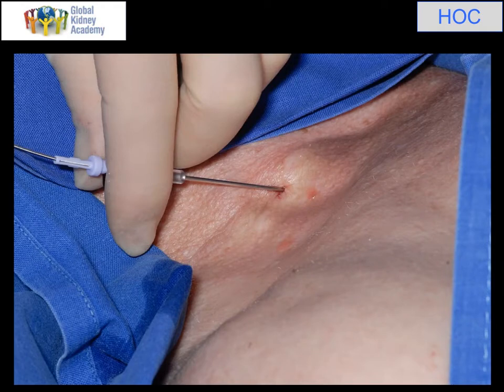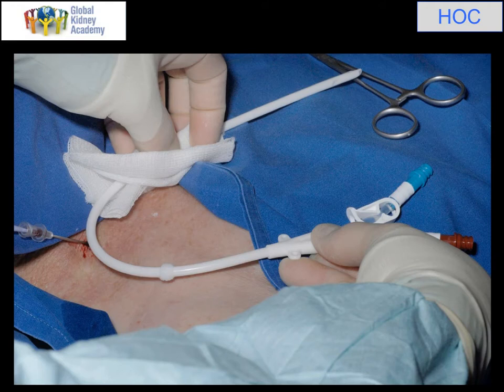I've now passed a wire through that needle. I've put some mosquito forceps clamps across the chest wall and I've used fluoroscopy to confirm that this is the middle of the right atrium. Now I'm measuring back with the catheter — I'm hovering it over the skin to work out where my exit site is going to be.